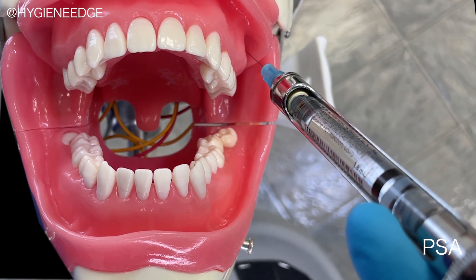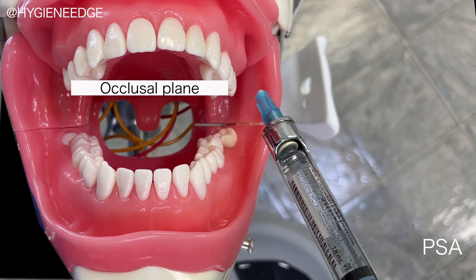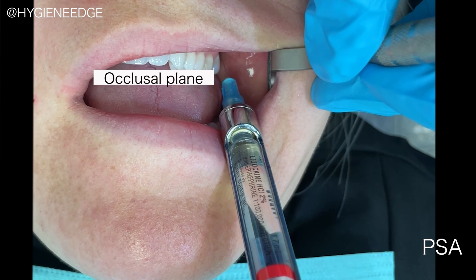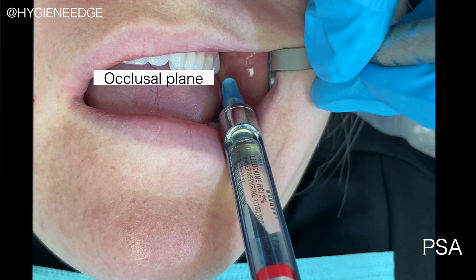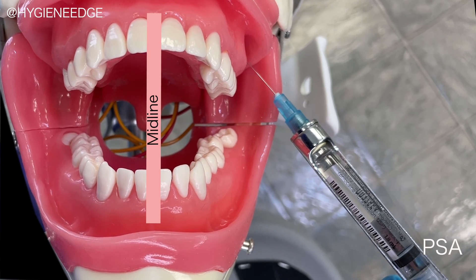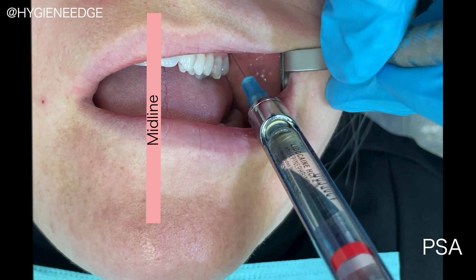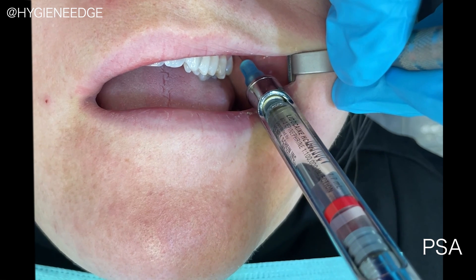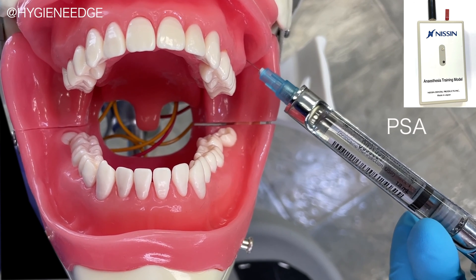and the needle is pointed upward, which you achieve by moving your hand 45 degrees downward from the occlusal plane, then the needle also needs to be inward as well, which is achieved by moving your hand outward 45 degrees from the midline. As you then advance the needle backwards, the sensor will be activated at the maximum depth and angle.